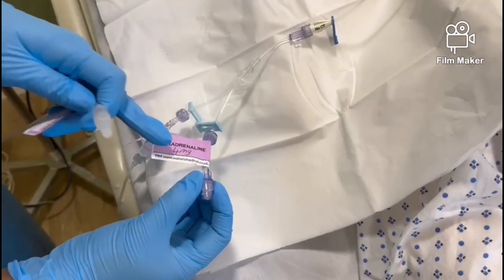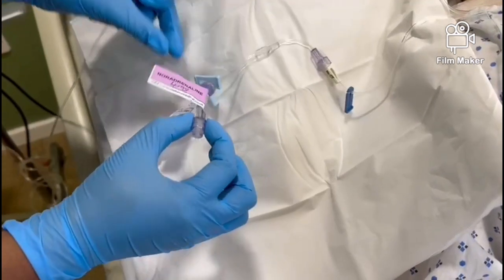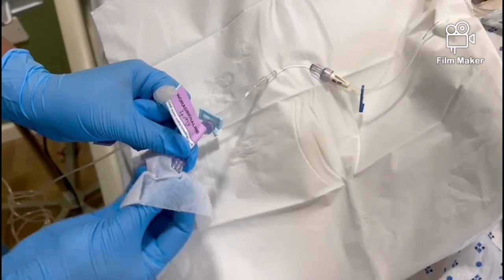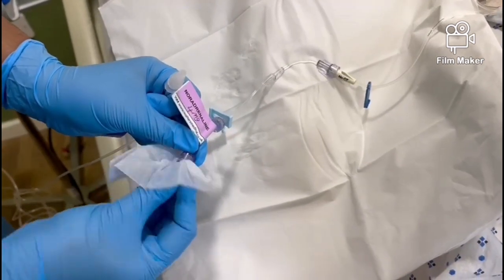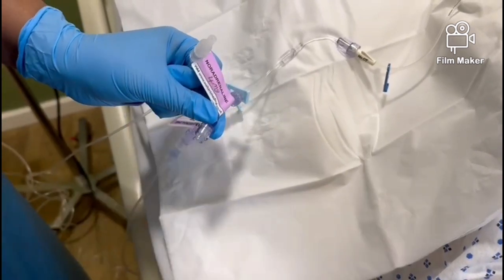As we have not yet double pumped, this lumen will still be free. This is where we will attach our new infusion. Prior to connecting, ensure you clean the hub for 15 seconds and leave to dry for 30 seconds.